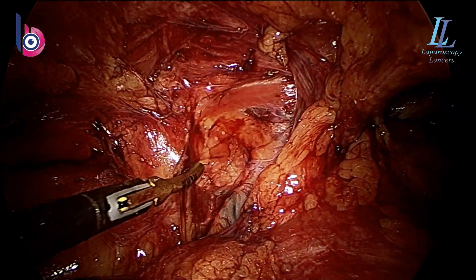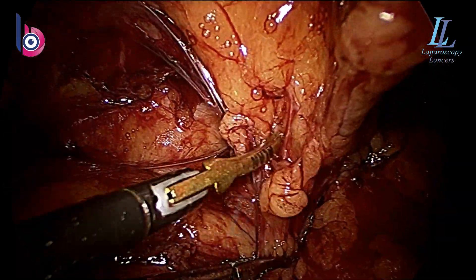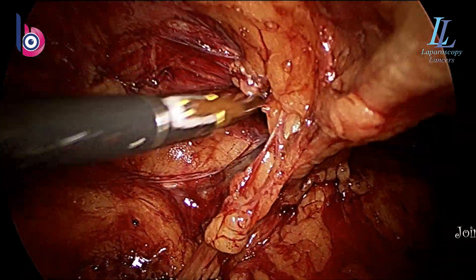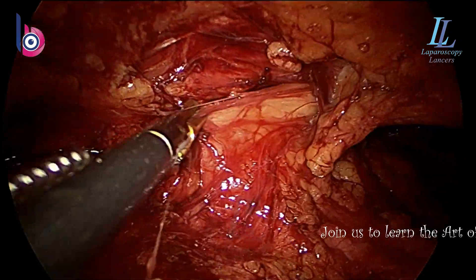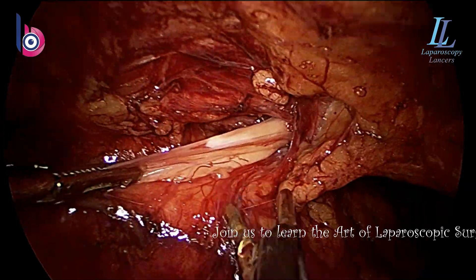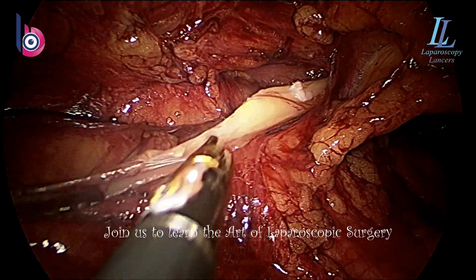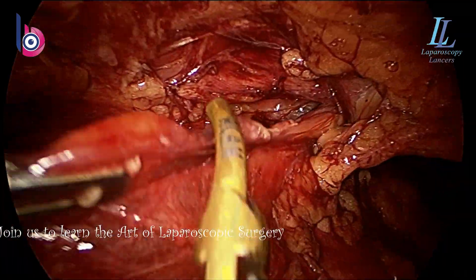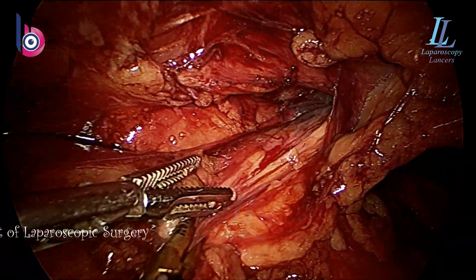By going behind the peritoneum again, the loose areolar tissue gets back easily. At some times you need to use the bipolar cutting force. Just step by step, easily, patiently — just keep on dissecting and the tissues do give way. That's the pseudo sac that we are seeing and I'm pulling it down. That's a bit of fat inside — lipoma of the cord. That's generally present in most cases these days.